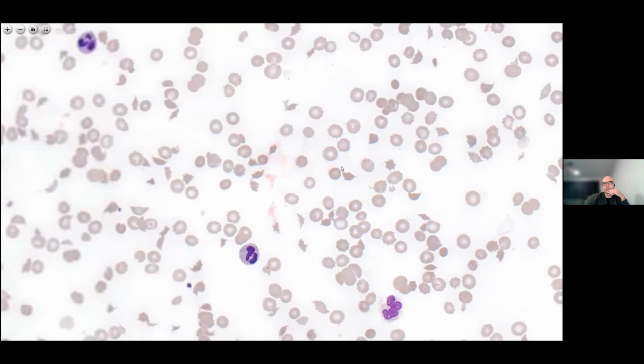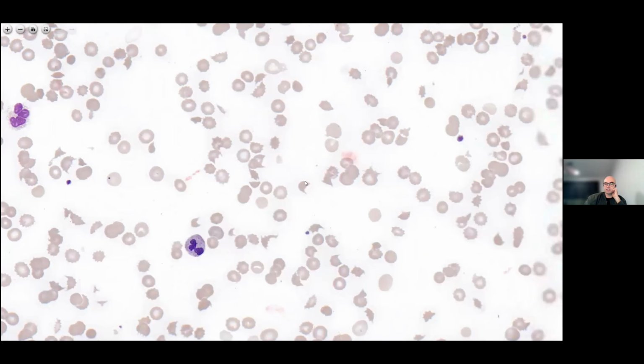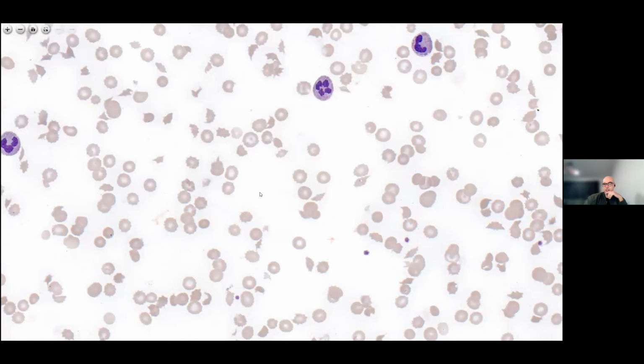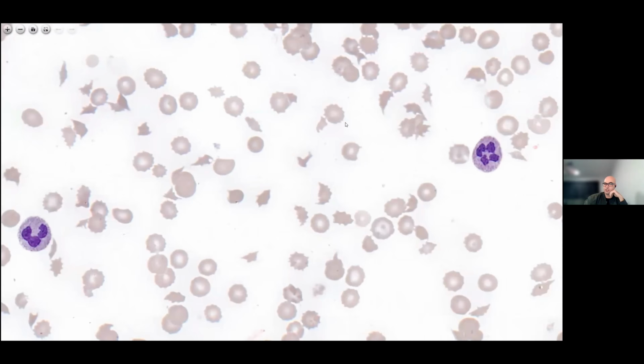So to summarize the red cell features that we've been seeing on this blood film, there's significant numbers of schistocytes, and schistocytes are these cells with pointed ends, and they're hyperchromatic, and they can also be a little bit crenated, so don't let that throw you off. Like this cell, it's got two pointed ends on the polar ends of the cell, but it's also got a couple of bumps along it that are crenation. And say this one, there's still a schistocyte.